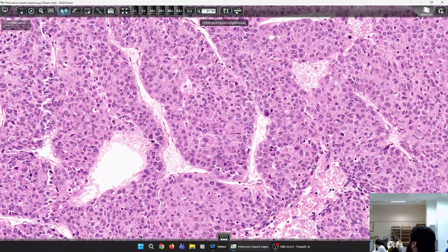When you have more than 6 cells thickness, it's macrotrabecular massive, as we call it. It harbors mutations of P53, and it is much more aggressive than the other. I didn't know that. Yes, they tend to have vascular invasion. They love vascular endothelium. Hepatocellular carcinoma spreads hematogenously, in contrast to the next malignant tumor, cholangiocarcinoma, which spreads to lymph nodes.